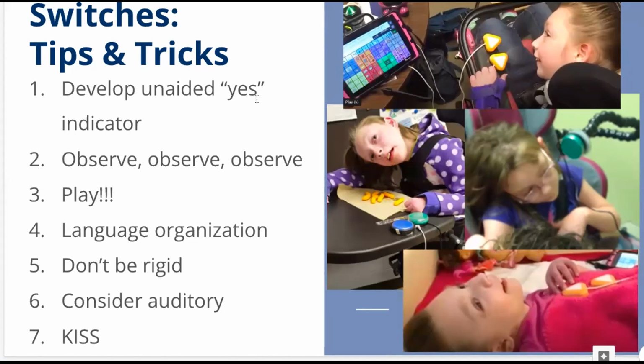And I don't mind 100% if it is hit a lot, because until they make their selection, there's no error. So they can be scrolling, and I do find sometimes teams will become a little uncomfortable because switch scanning users will frequently just scroll aimlessly.